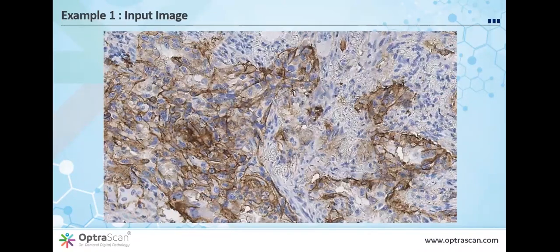Okay, so here's the interesting part. Let's now begin with a quick activity while presenting some of the intuitive features of the automated PD-L1 analysis tool. For this activity, we've identified a few interesting cases out of the many which were used for the above study. So here's an example. What you see right now is a 20x scanned region of an IHC stained non-small cell lung carcinoma sample. Let's observe this region for a few seconds before we apply any sort of analysis.